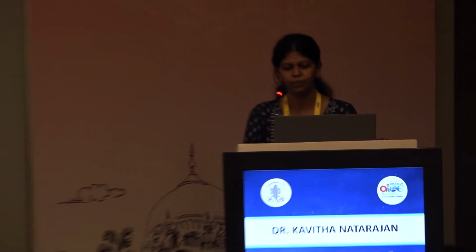So, pediatric cataract itself is very challenging, and on top of that, managing trauma in the setting of children's eyes is double challenging, as we all know. And for pediatric traumatic cataract, I'm going to just brush through some challenges we face and tips that we can follow. So first, it is step by step we have to manage. First is to restore the integrity of the globe, if it's a globe trauma. Second is to clear the visual axis, and then optical correction and amblyopia treatment. This is the order we should follow.